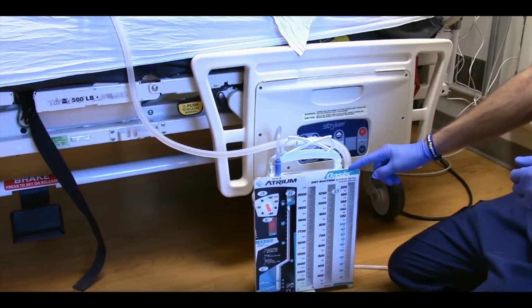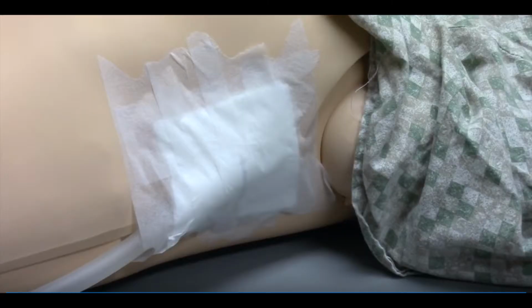So you want to observe the drain insertion site, check for any signs of infection or inflammation. You want to make sure the dressing is clean and intact. So this is going to make sure there's no obvious signs of leakage through the site. There's no blood that's coming out through the site.